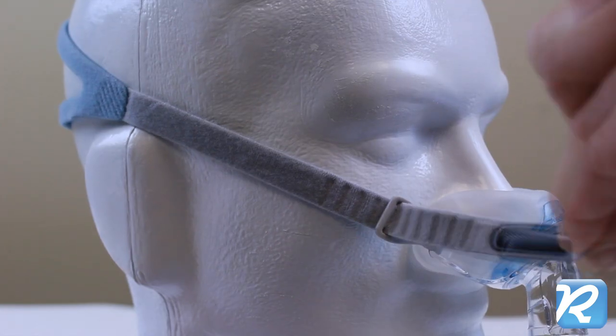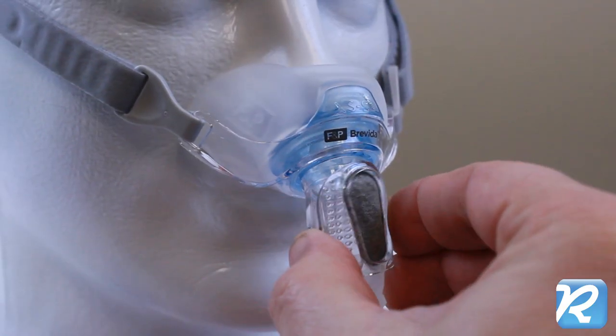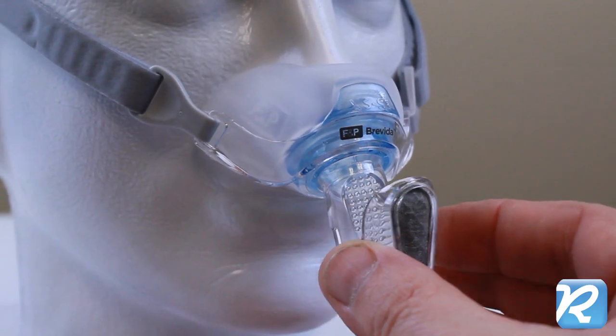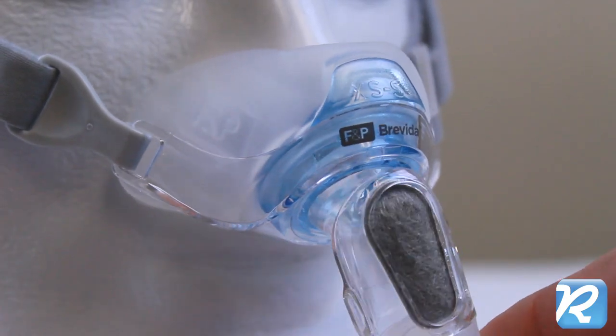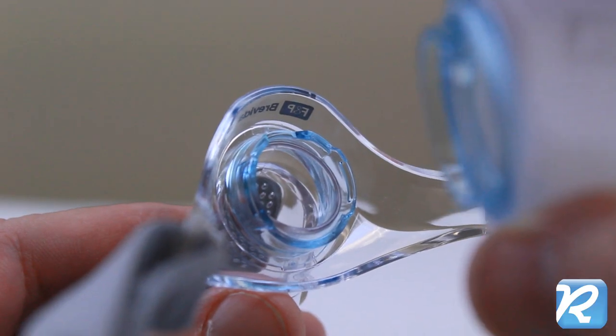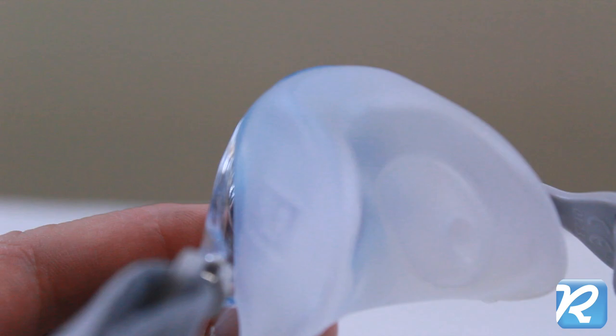Notches lock the headgear firmly into place. A washable cloth diffuser covers microports to keep exhaled airflow extra quiet. A ball and socket swivel minimizes drag from the CPAP tubing. VisiBlue highlights guide assembly so you can always be sure the mask is put together correctly.